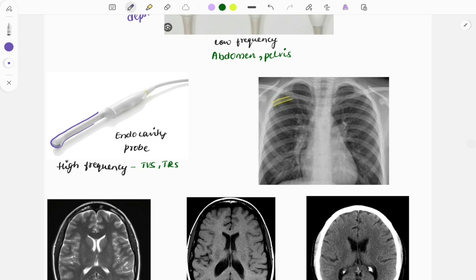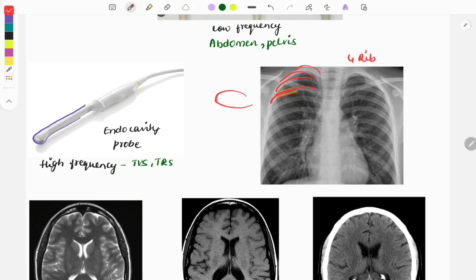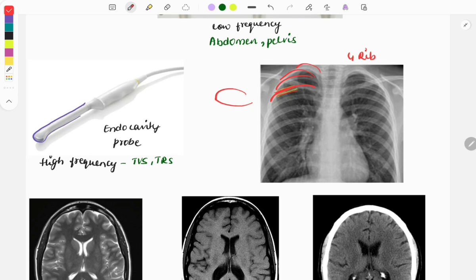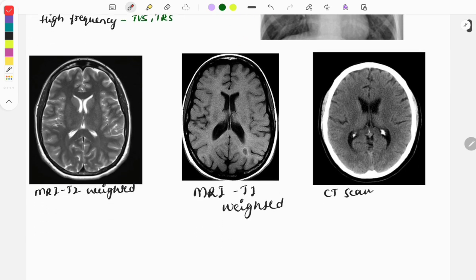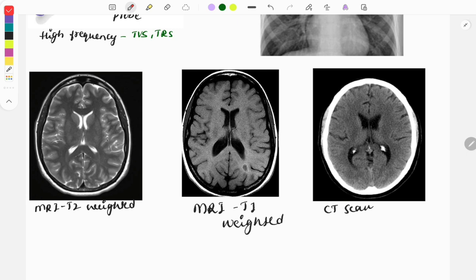Moving on, here is a chest X-ray where ribs are marked and questions are asked to identify which rib is indicated. You can see the first rib, second rib, third rib, and fourth rib. Based on the marked rib, you need to identify which rib it is.